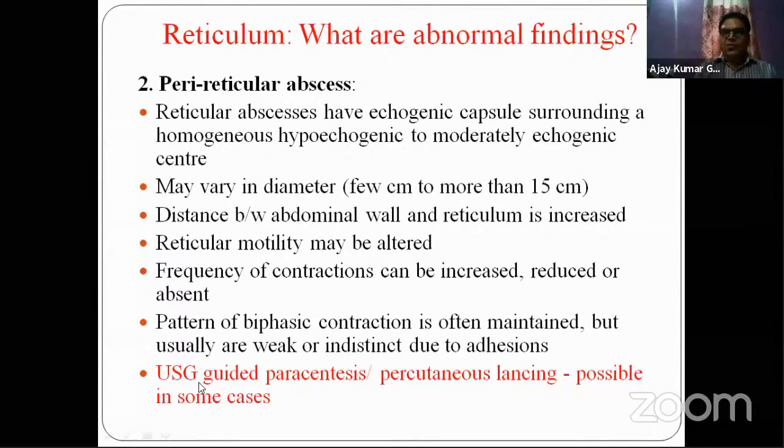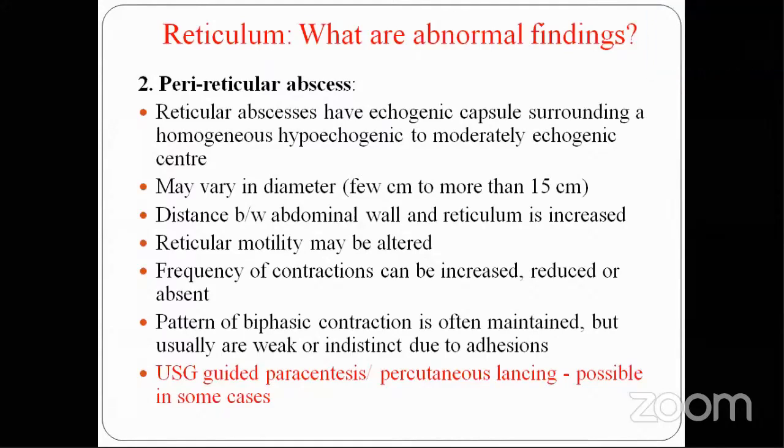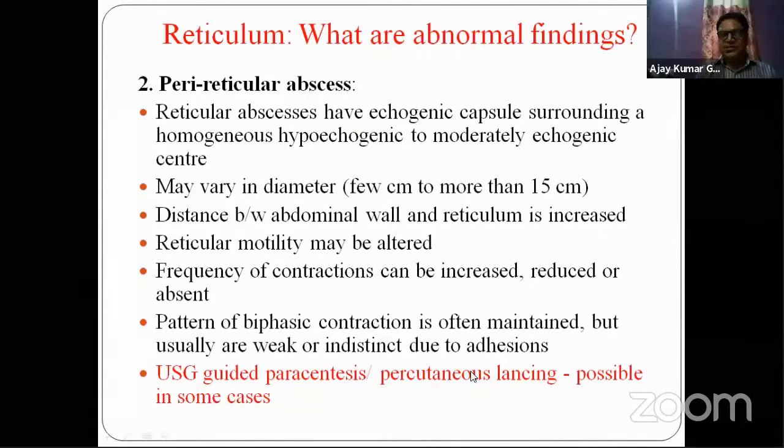Once you diagnose the abscess ultrasonographically, and if it is within approach, it can be drained using ultrasonographic guidance through percutaneous lancing. But this is possible only in those cases where the abscess is in direct contact with the abdomen and is in a comparatively fixed position.